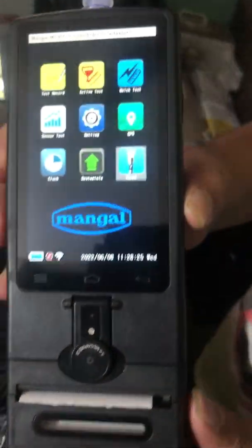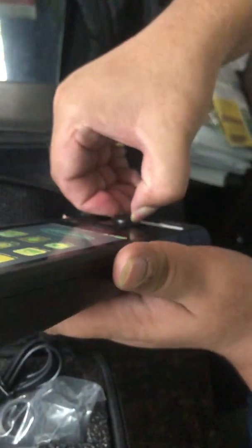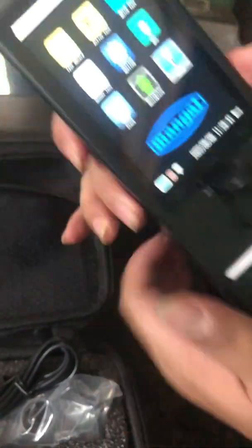Now, the most important thing in this device is the camera. You have to flip it open, something like this. And this is a printer — this is where you put your paper roll.